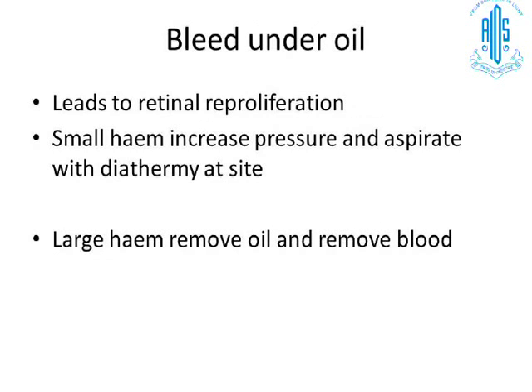Bleed under oil, as I think has already been covered to some extent by Sharat. If it's a small bleed, you can leave it. If it's a large bleed, at the end of surgery also, spend 30 more minutes, remove that oil, stop the bleed, and then put oil back. Because otherwise you will have to do that 3 or 4 days later.